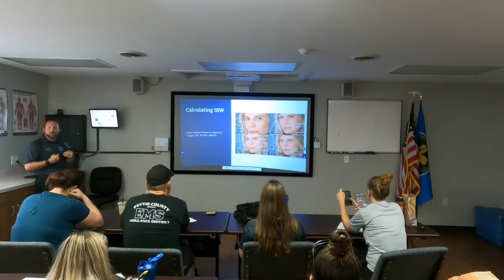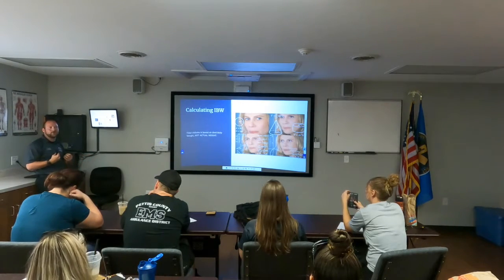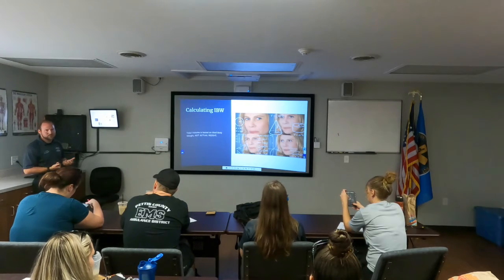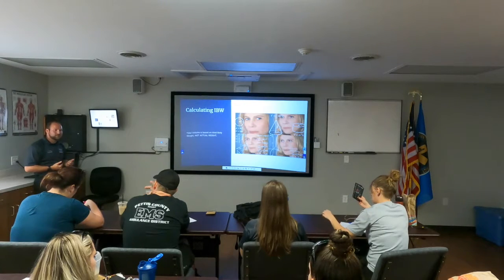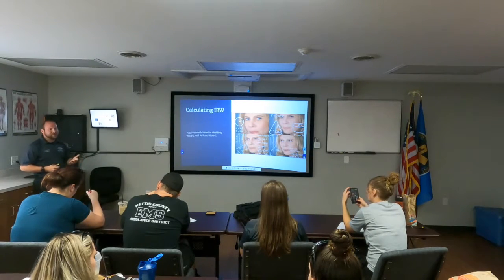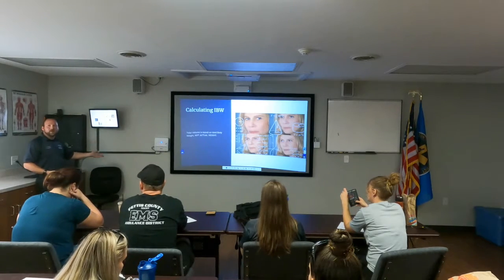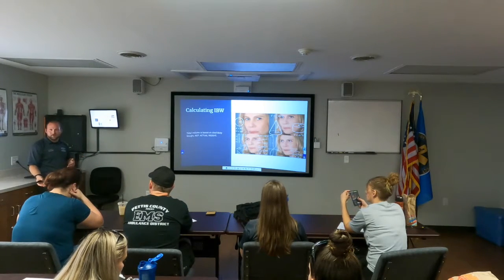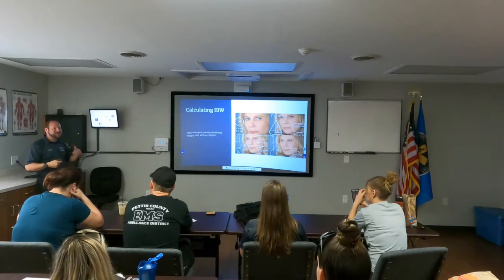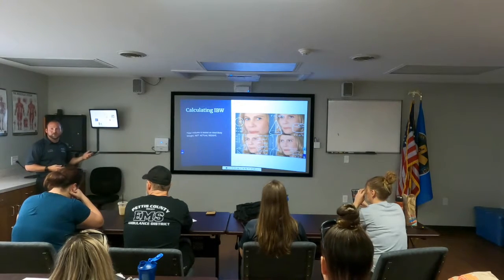Why is ideal body weight so much more important when it comes to calculating tidal volume as compared to doing it off of actual body weight? Well, it's the same thing as medication. If you have somebody that's 600 pounds, you're going to overinflate the lungs, like you over-medicate them. Yeah, depending on which medication, because some medications are water-based, some are fat-based, but yes, the idea is that a 600-pound individual that is 5'4" and a 150-pound individual that is 5'4", body mass is different, but your lung size is the same. So they receive the same amount of volume regardless of how large they are.